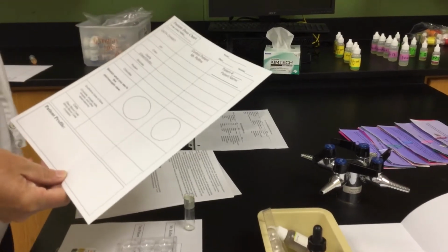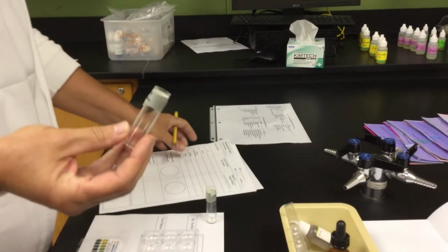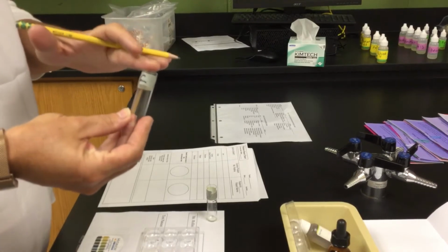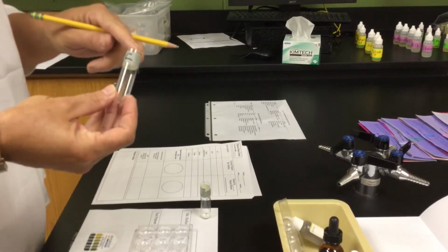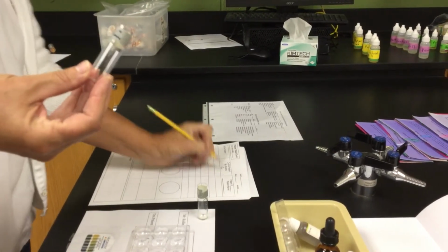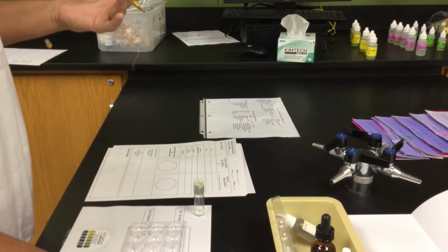So to start out with, those who are in class, it says control patient Mr. Rollins. You're going to get a tube. This little gray tube is going to have a letter on it. It's important because this gray tube eventually is going to make its way to the water bath because we're testing glucose in it with Benedict solution. And Benedict solution actually needs heat to activate the solution for it to change color. So you just want to write that down to make sure you know which tube is yours, because you want to make sure that you're pulling the correct tube each time.